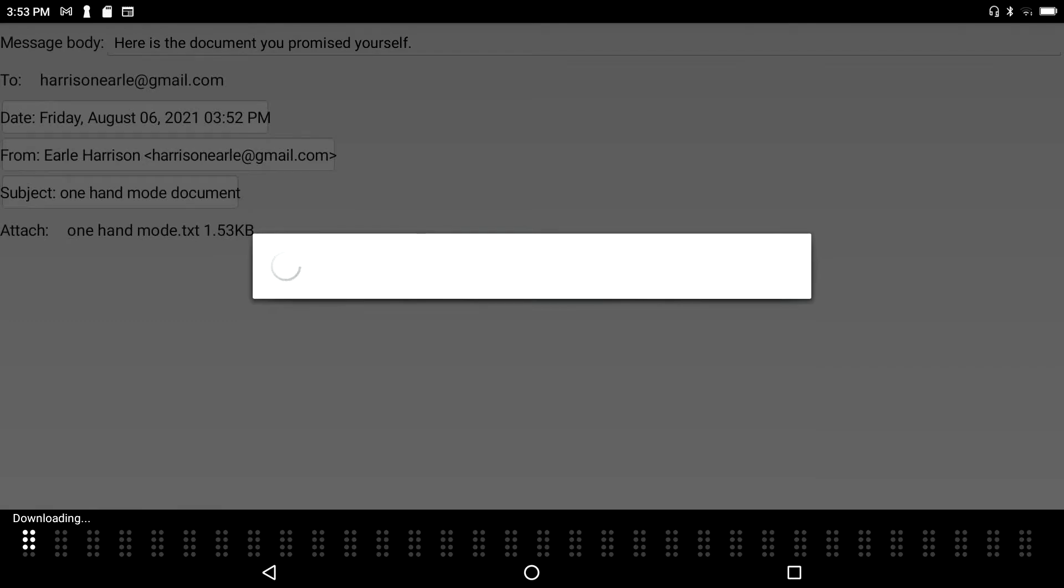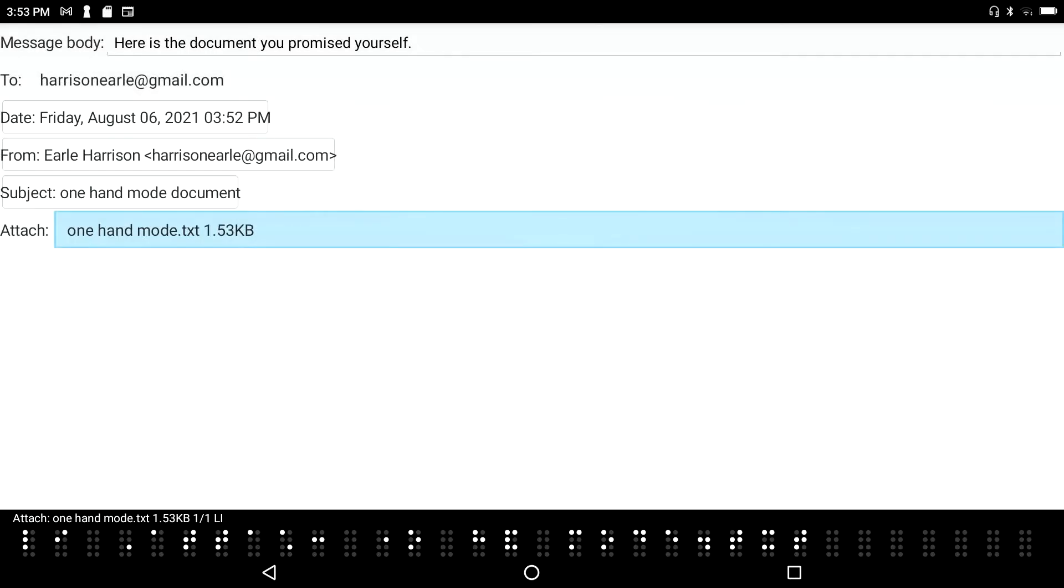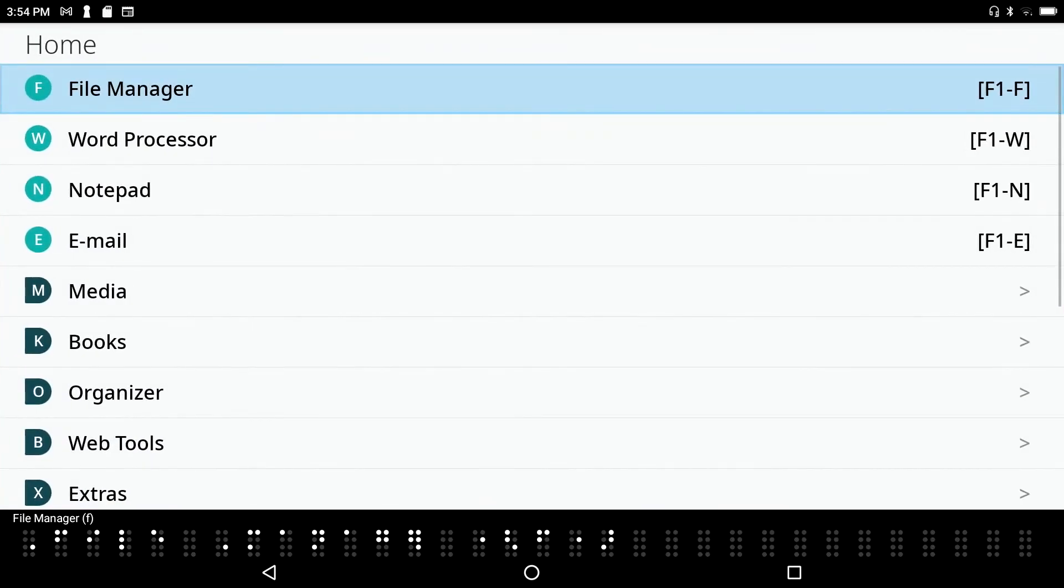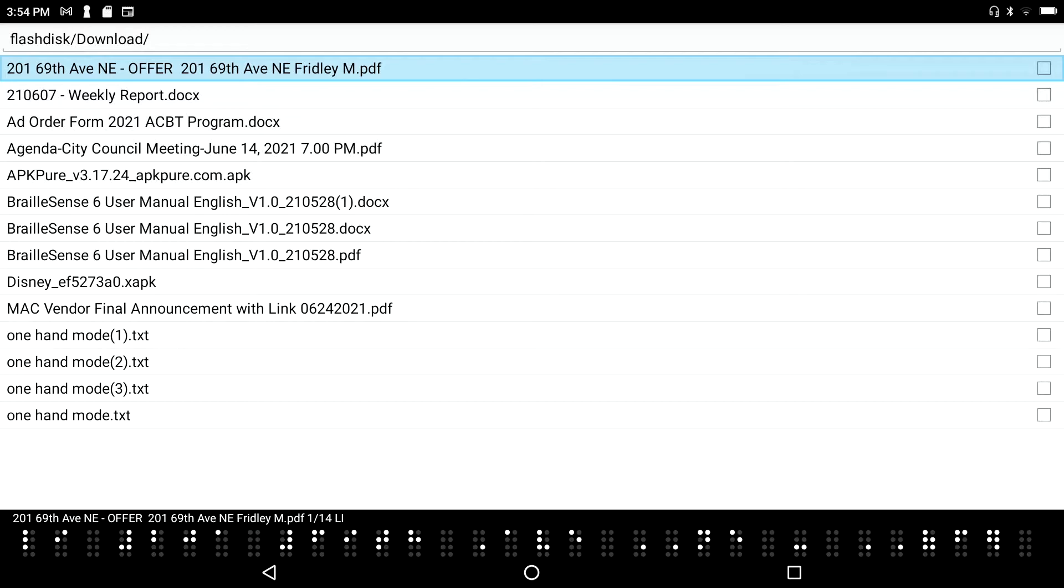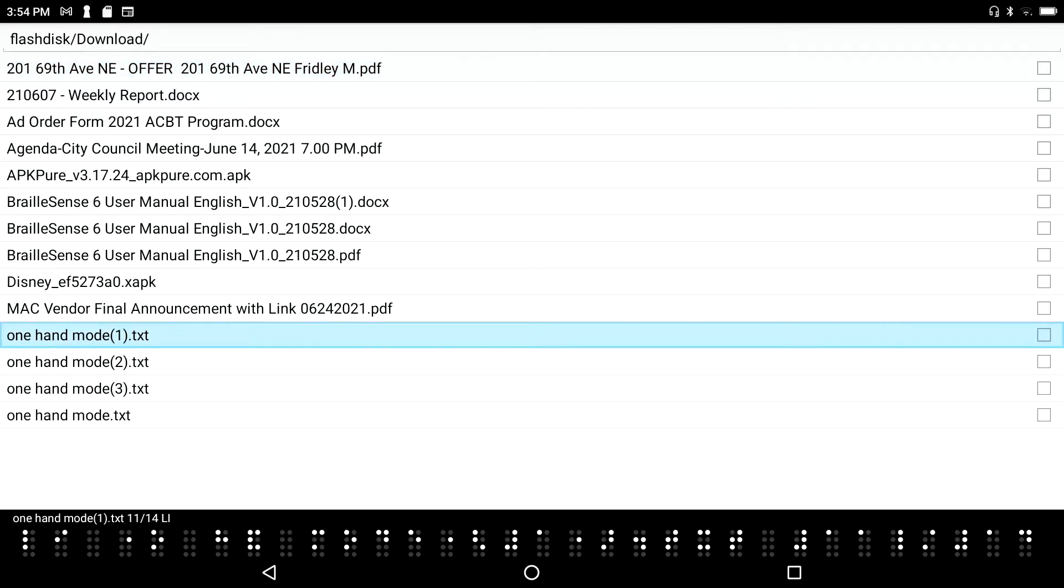One hand mode txt 1.53 kilobytes one list item. Now let's go to our file manager. I'm just going to press F1 file manager and enter to go in here. 201 69th Avenue NE offer 201 69th. Okay so I'm going to press O for one hand mode.